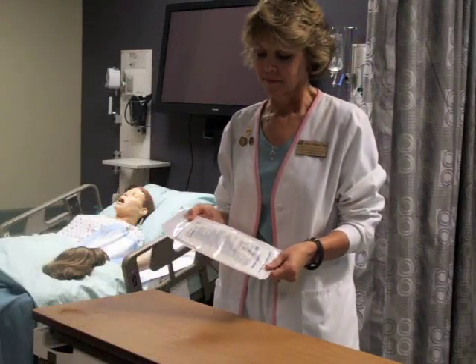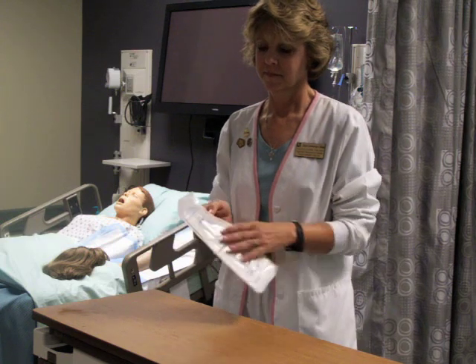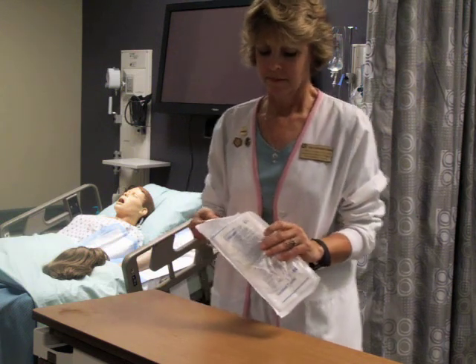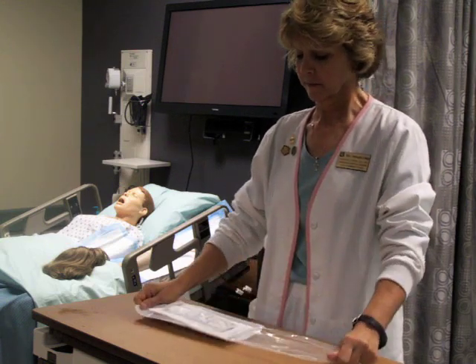Additional information when donning sterile gloves: select the proper size for maintaining sterility during the procedure. Open the package, maintaining sterility of the gloves.